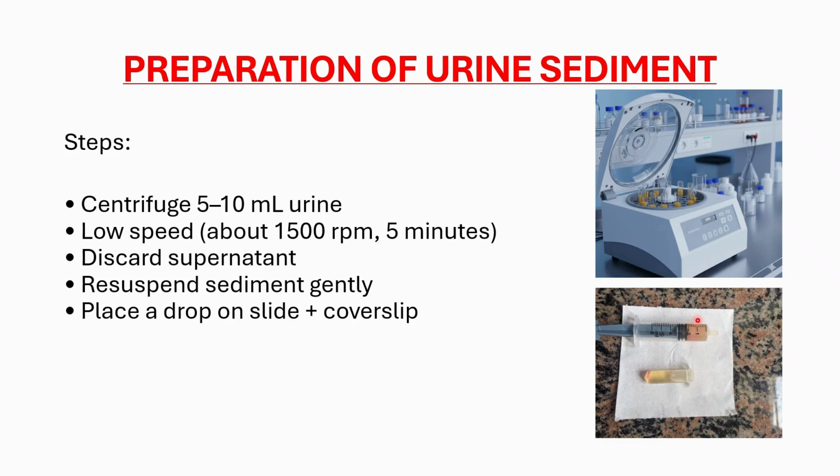So this is a urine sample. Here it will look like this after centrifugation. This is the supernatant, here is the sediment. Okay, we have to discard the supernatant, resuspend the sediment, and examine under the microscope.